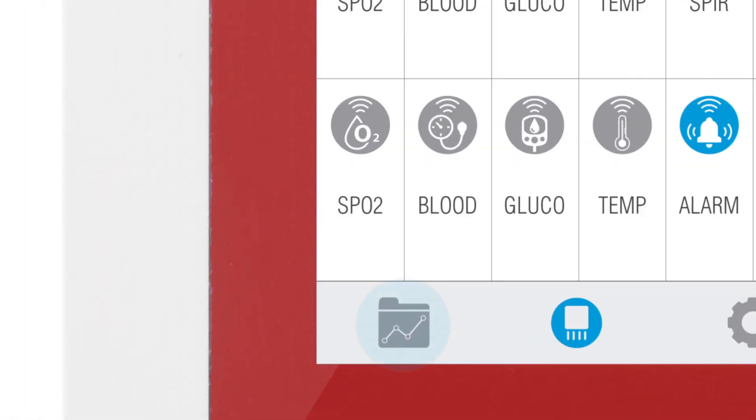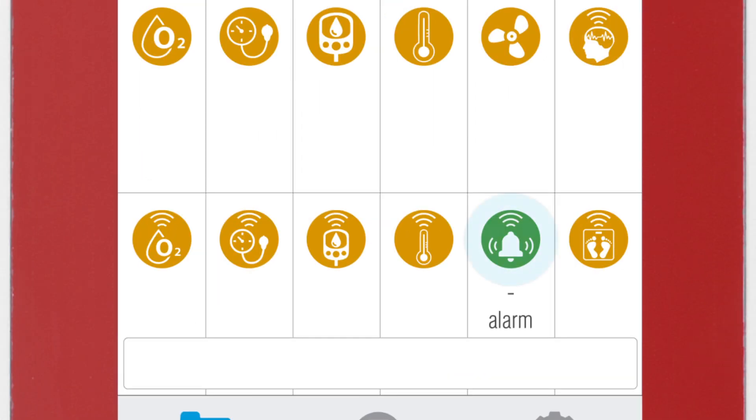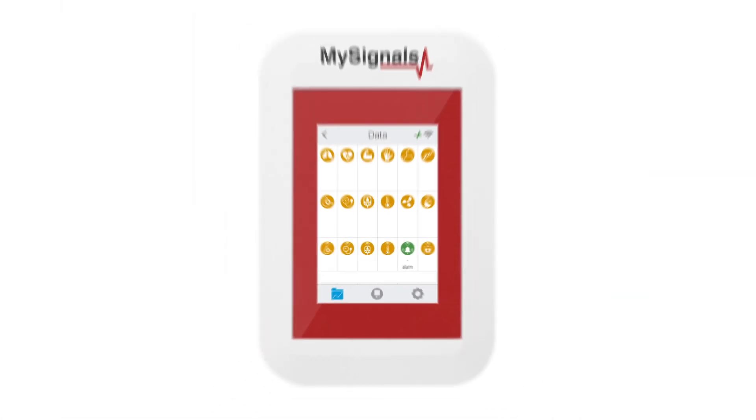Then, click on the Data button to access the data screen and start visualizing the data. Click on the Sensor icon to start real-time data visualization.